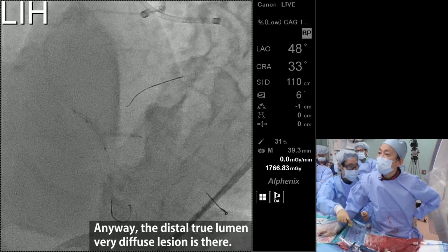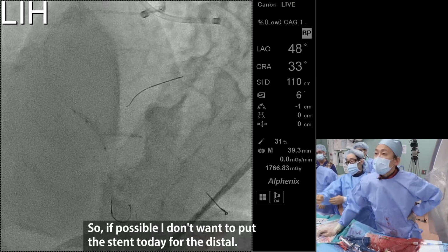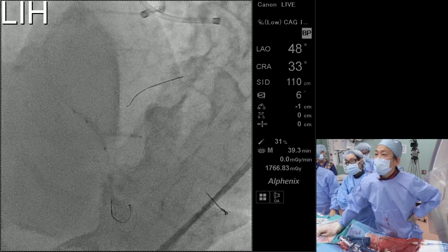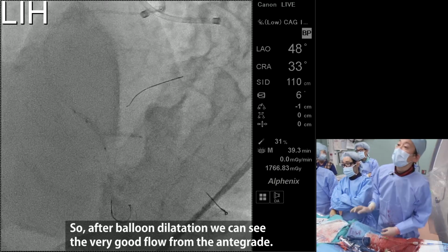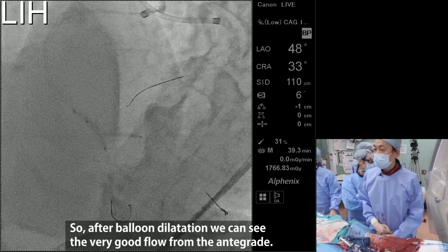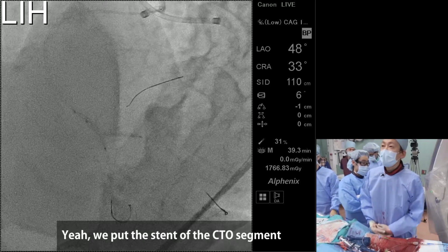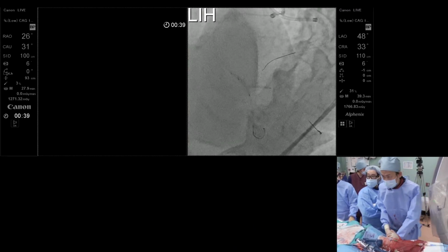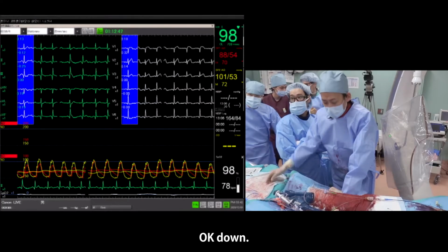Anyway, the distal region remains very diffuse disease. So if possible, I don't want to put a stent today for the distal. After balloon dilatation, we can see very good antegrade flow. Yeah, we put the stent in the CTO segment and then finish the case. Okay, done.